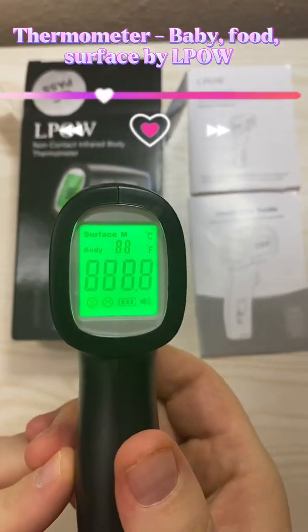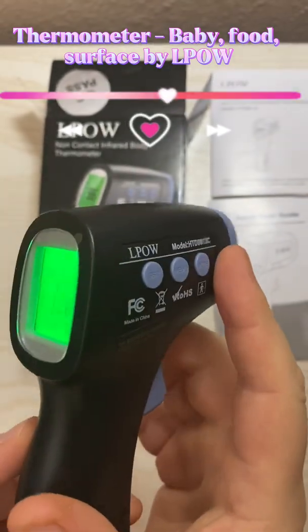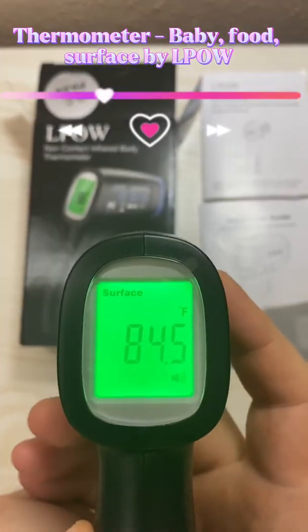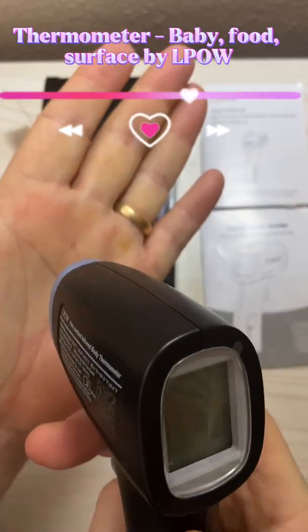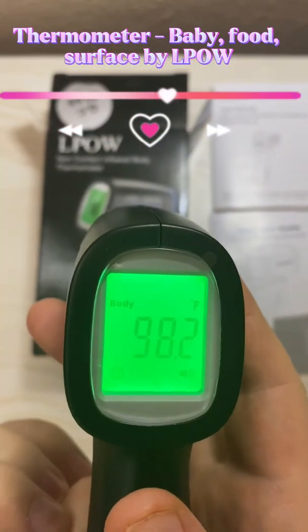You can use these buttons to adjust between Celsius, Fahrenheit, and body and surface modes. If I press the mode button here, you can see I'm switching between surface and body. I'll give you a demonstration for body temperature — I'm on Fahrenheit since I'm American. I'll measure myself. You can see it pops up — I'm 98.2.